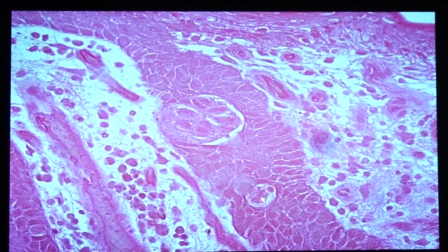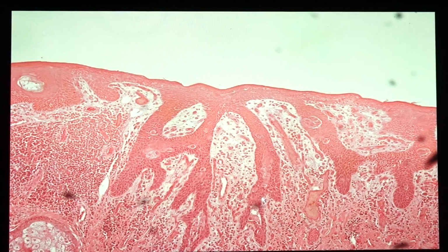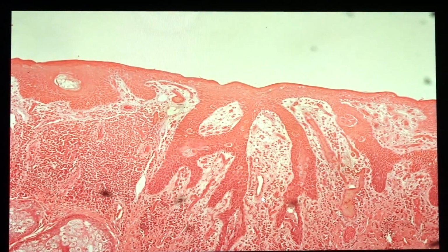Okay. So if we're going to test for the immunohistochemical markers, usually they are estrogen receptor negative, and HER2 positive. Okay. And then next we have slide 218.